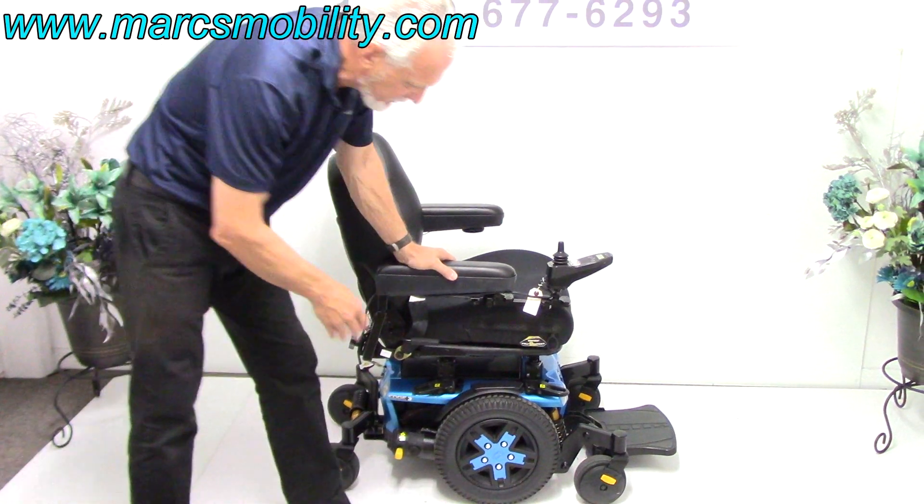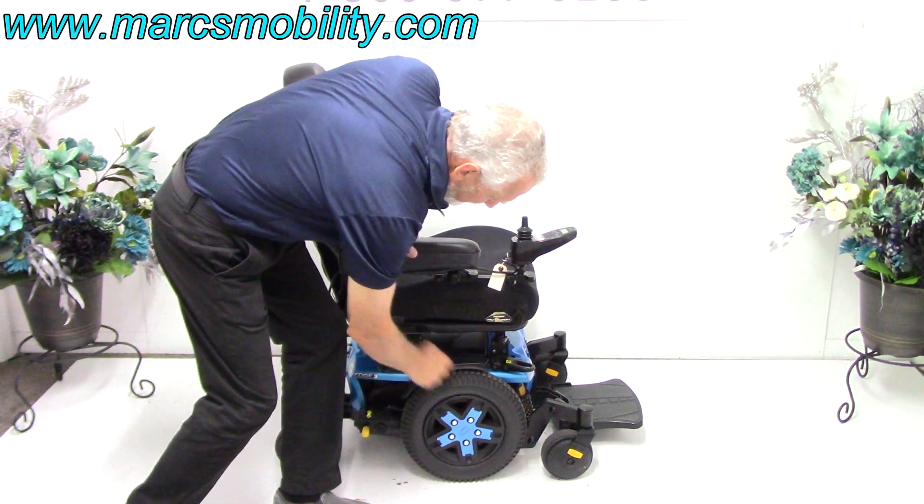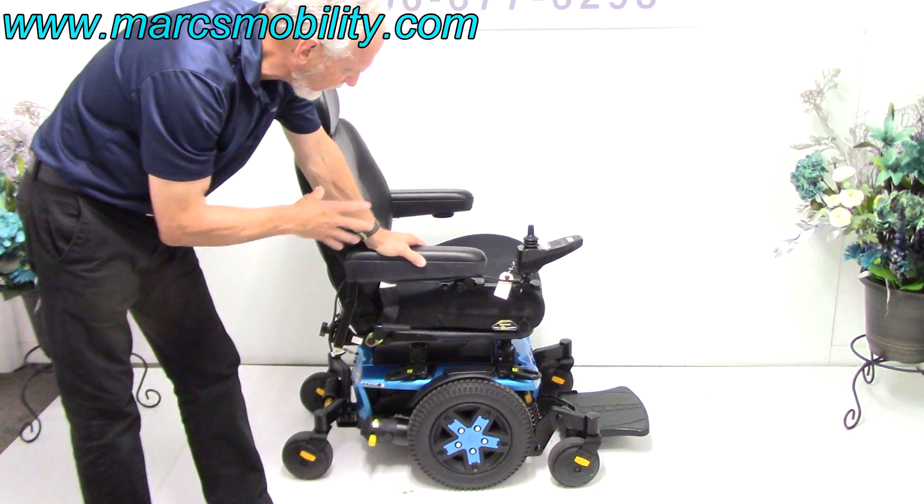You can tell it's the newest because the color here matches the color of the chair. It's a beautiful blue color.